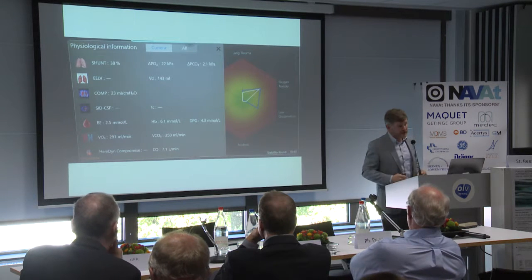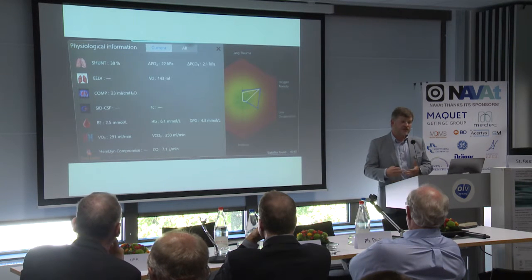And if we could follow that description of the patient, we can start thinking about deep physiological monitoring. We can start thinking about intelligent alarms, alarms that pop up and say shunt has increased by 10%, rather than the pulse ox has fallen off. We've done a little of this ourselves.